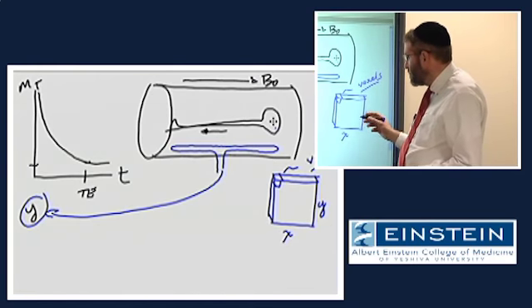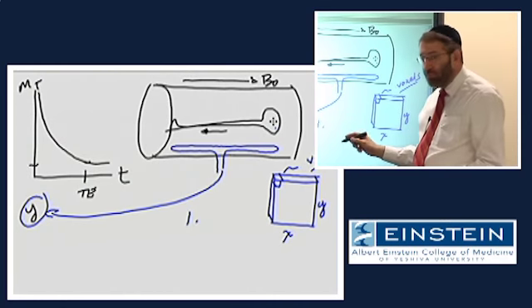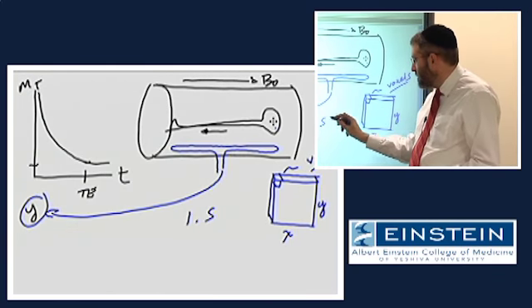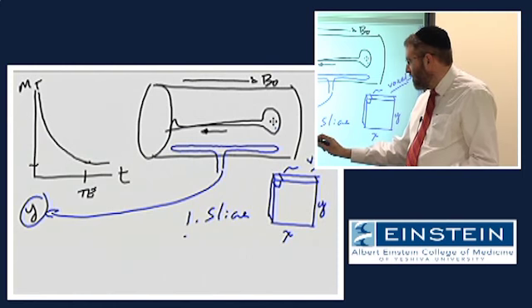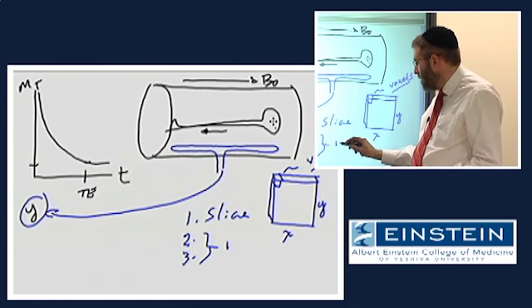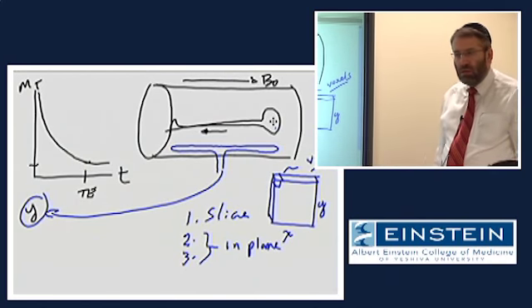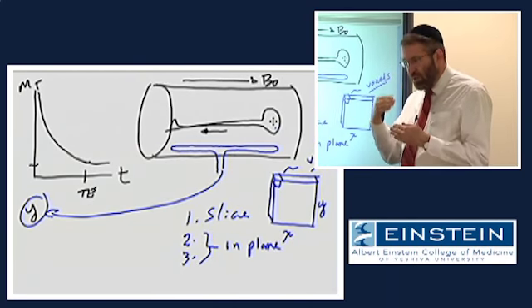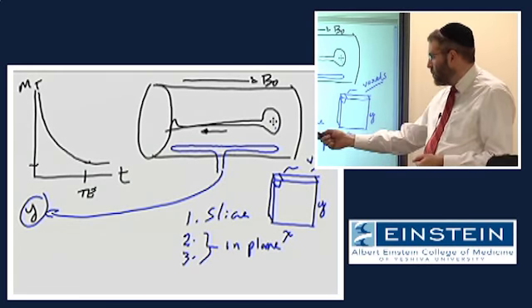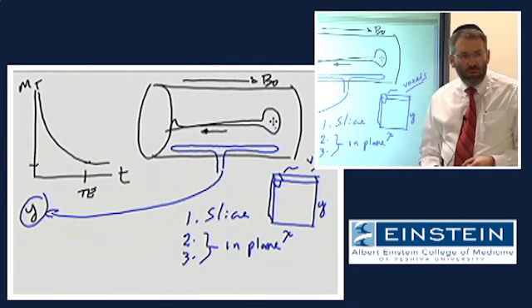So in order to approach this, we're going to take a stepwise approach, which is the first thing we're going to do is try and simply select information from a single slice. And then followed by that, we are going to address in sequence localization in the plane of that slice. These are essentially three different components of spatial localization. The easiest one has to do with slice selection, and hopefully we'll dispense with that relatively quickly this morning.